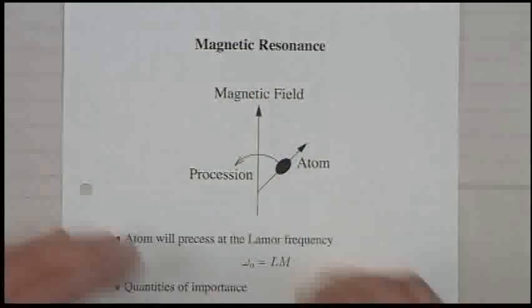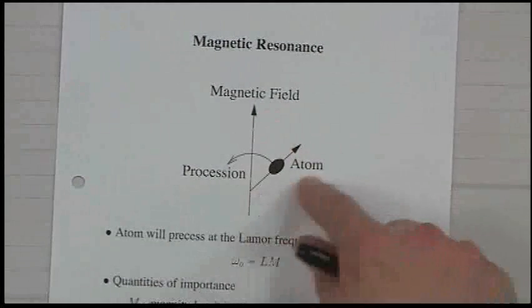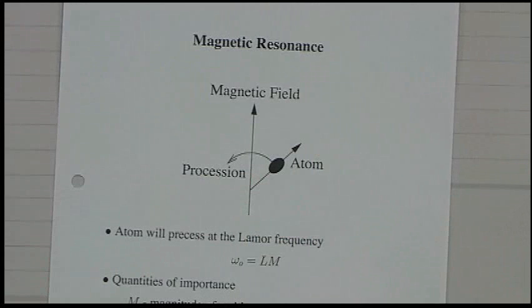the precession frequency, okay? So now the trick is going to be, we're going to use this and use Fourier transform techniques to reconstruct a 3D cross-section of the tissue in a human. And we'll talk about this next time in more detail.